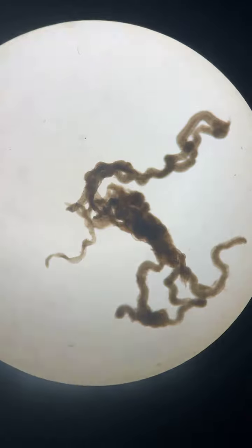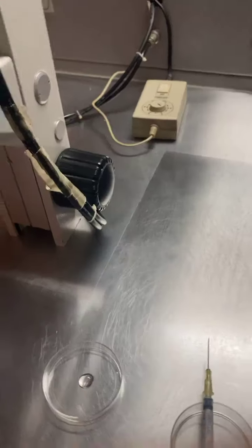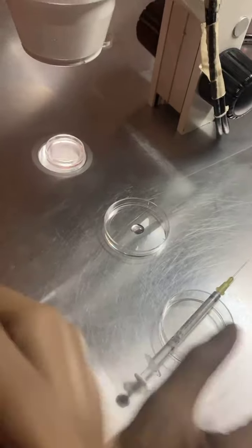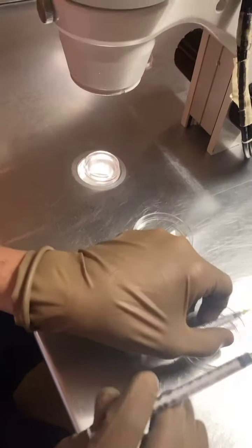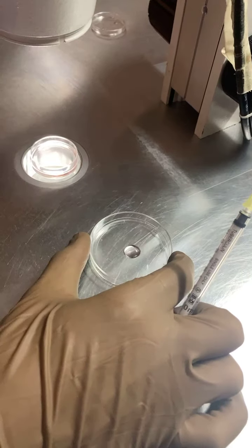Through this entire effort of teasing a seminiferous tubule — the camera now goes to the hands of my assistant Anusha. I'm going to use two small tuberculin syringes. I have placed some HEPES out here.